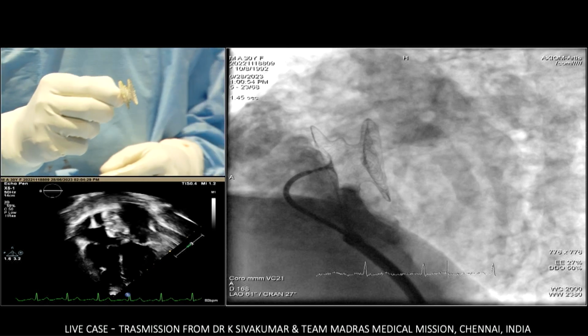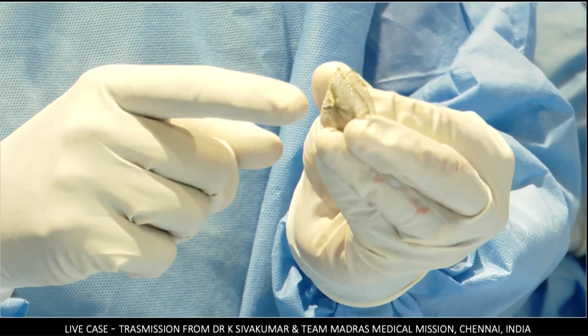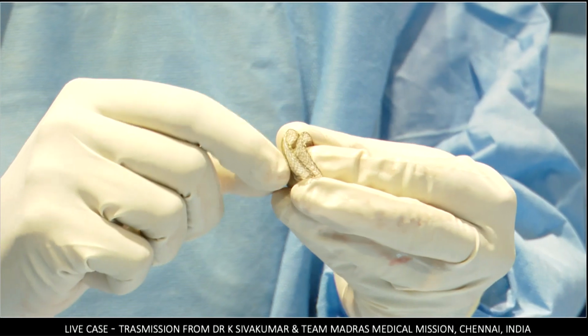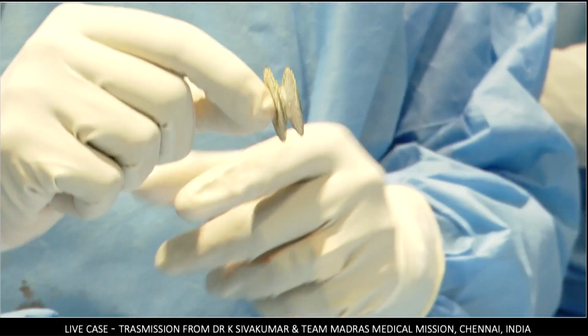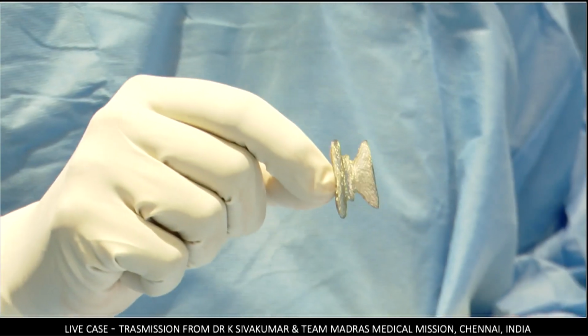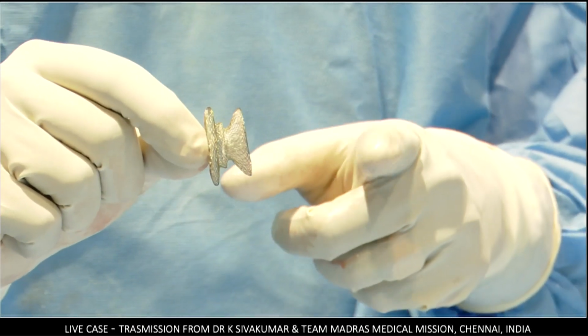So retrievability probably is not an issue. And number two, even after you release, if you have to retrieve, the screw is quite long, so you'll be able to catch it. That's the second part. The first part, does it look more separated? True, I'm making it look very separated by making the LA disc really concave, and there is quite a good amount of separation.